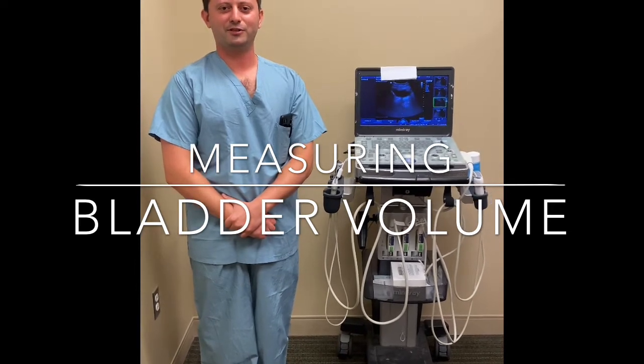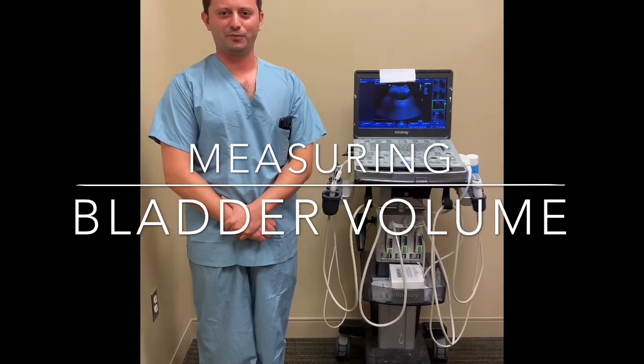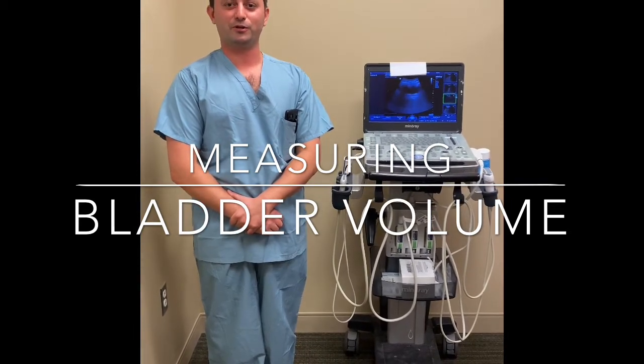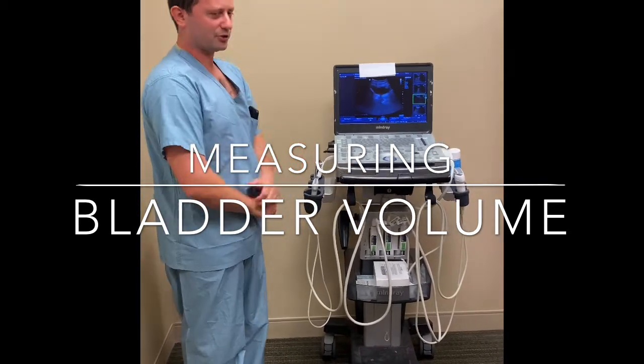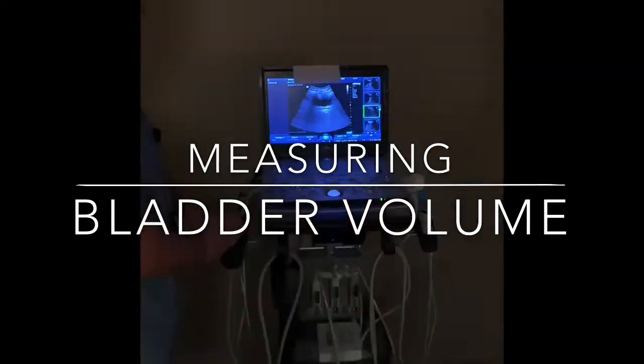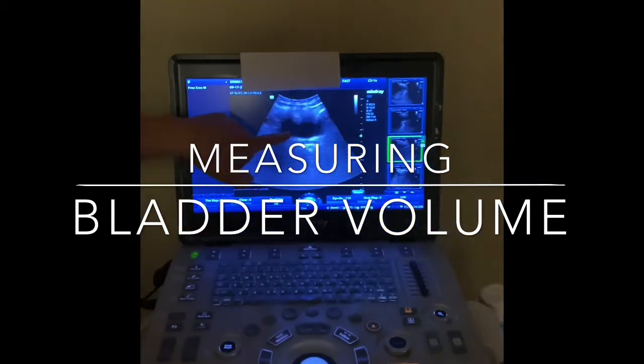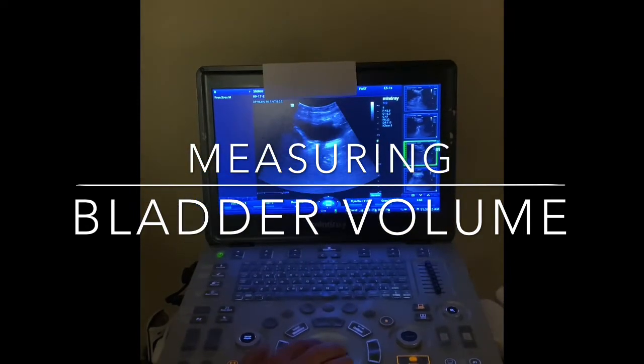Today we're going to briefly talk about measuring bladder volume. This has been a question that frequently comes up, and hopefully this very short tutorial will be helpful. If we focus our attention to the ultrasound machine right now, you can see that we are scanning through the bladder in short axis.